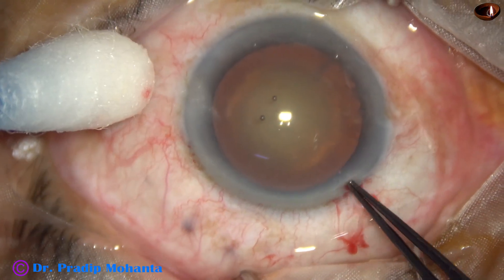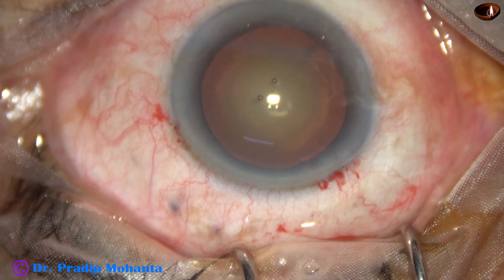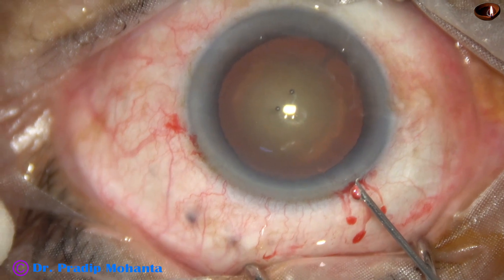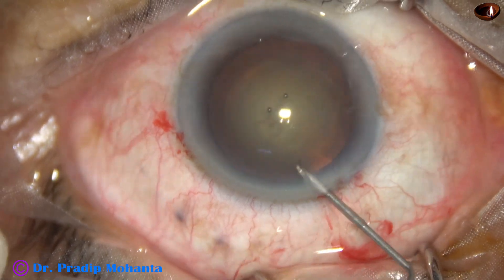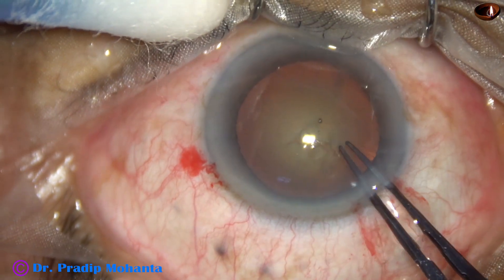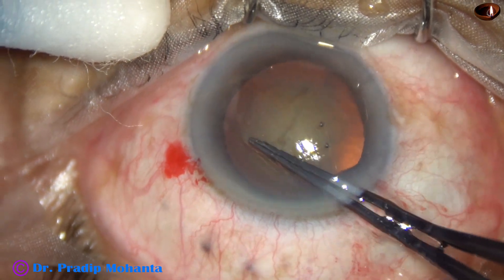Capsulorhexis is done with the help of utrata forceps. In this case, I could not make a puncture with the utrata forceps, so I take a needle and cut the anterior capsule at the center and raise a capsular tag. I hold this capsular tag and go anti-clockwise all around to get an adequate sized rhexis of about 5 millimeters.